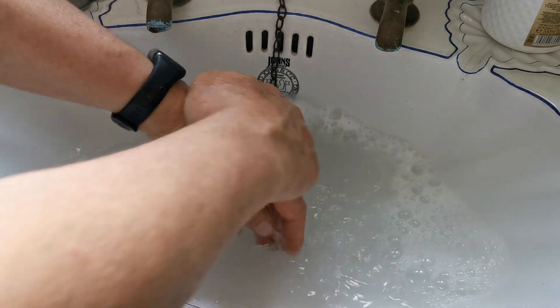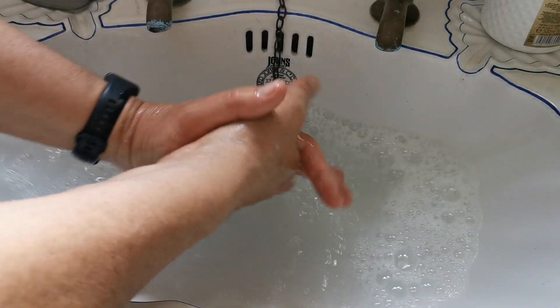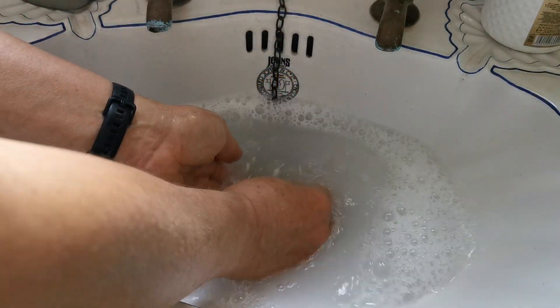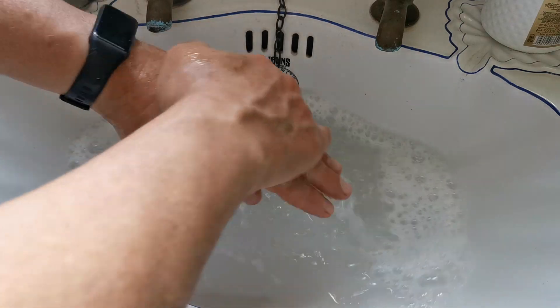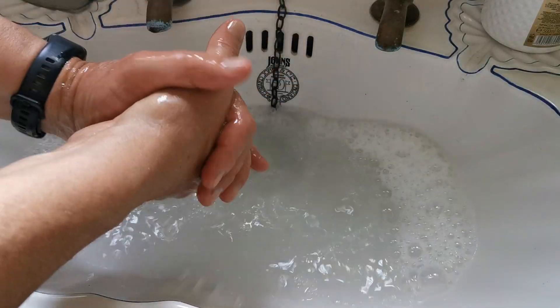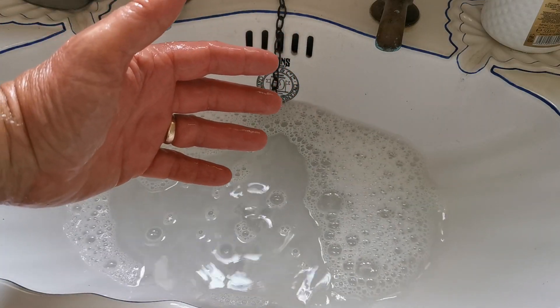Do this for about 30 seconds to a minute. This also removes any dirt and contamination of your finger, making it a really nice clean area for your lance. This is absolutely critical. It really does make a big difference warming up the hands and getting them really nice and pink.